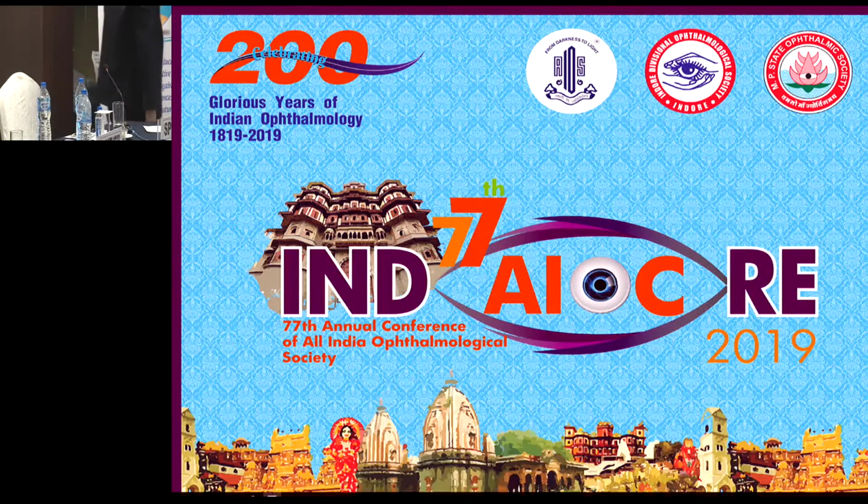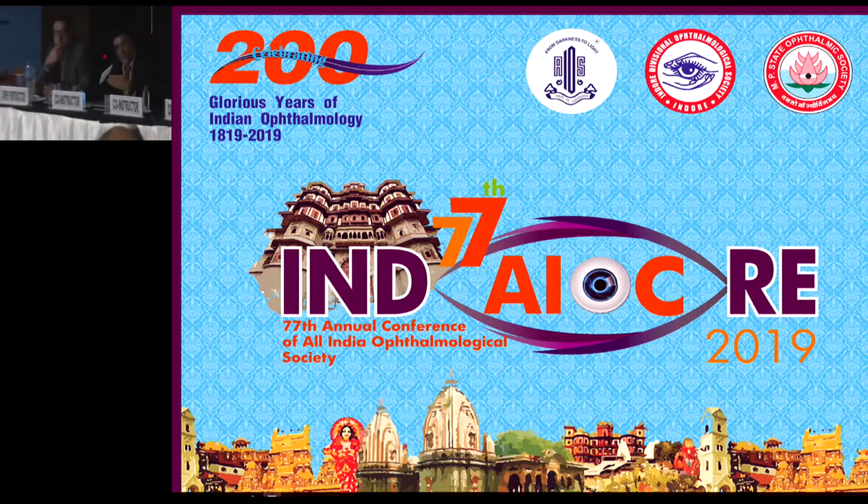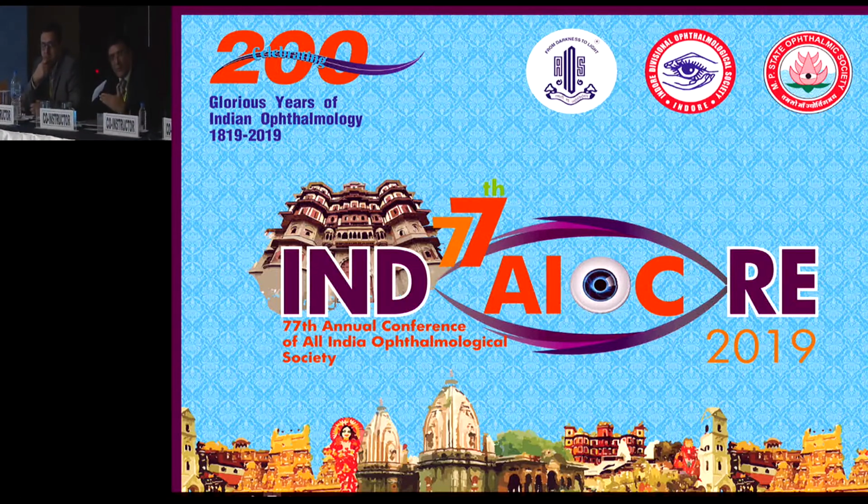Another comment is the dark areas on OCTA are areas where there is no flow or low flow, or it can also be a high flow which an OCTA doesn't pick up. So an OCTA image goes to a place, and once the RBC moves ahead, before it can come, if the flow is so rapid, we will get a no flow area which actually may be a high flow area. So that is where the artifacts are coming in.